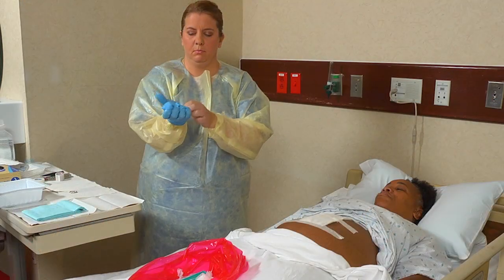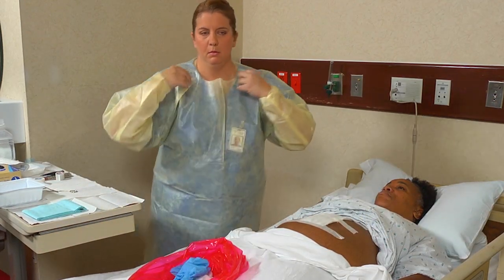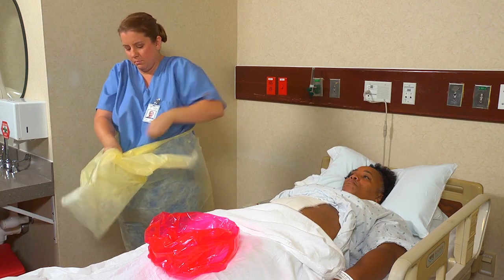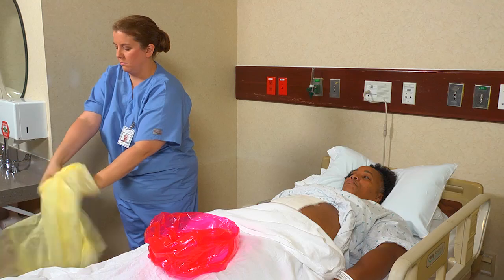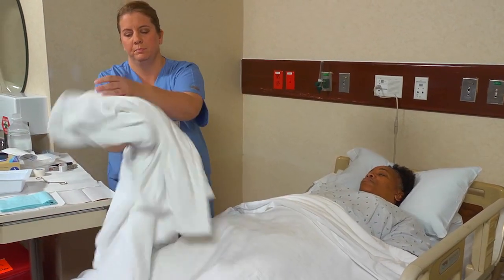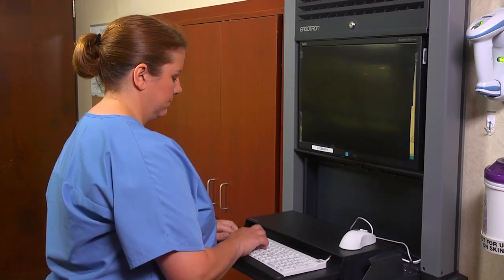When the dressings have been secured, remove your gloves and put them in the bag. Discard used supplies in the bag, tie it closed, and discard it according to agency policy. Also, remove and discard your personal protective equipment and practice hand hygiene. Finally, cover the person and remove the bath blanket. After applying a dry, non-sterile dressing, perform post-procedure care.